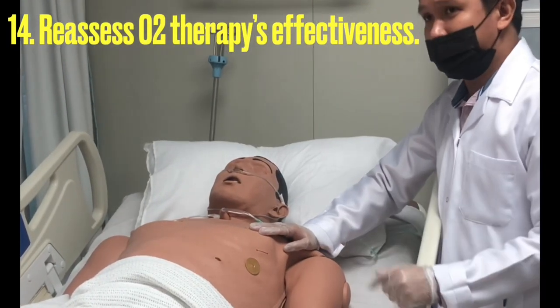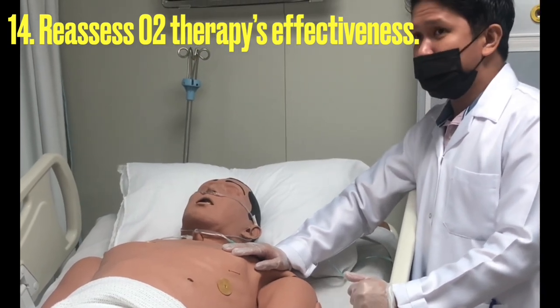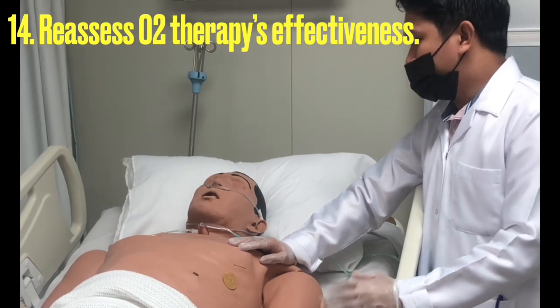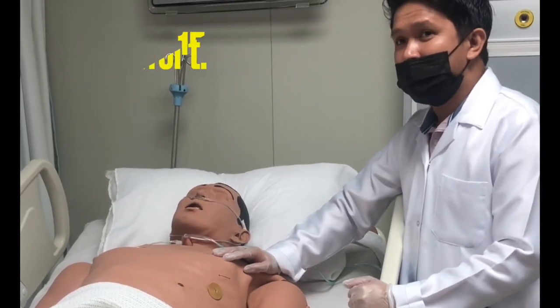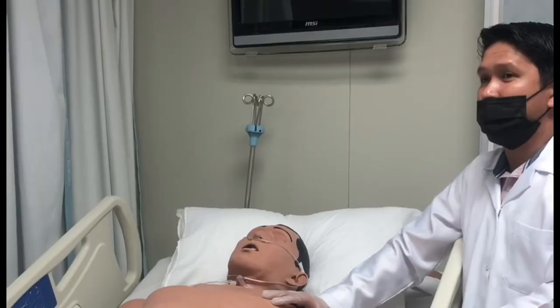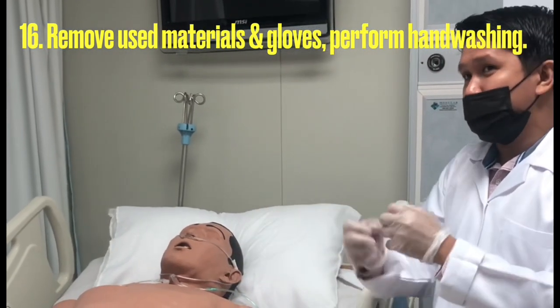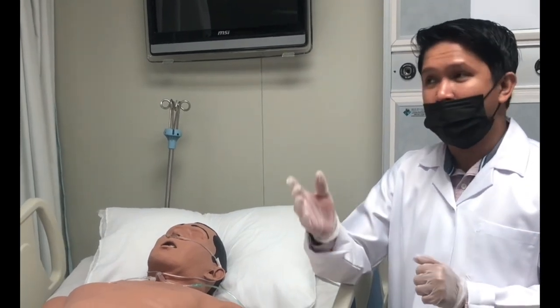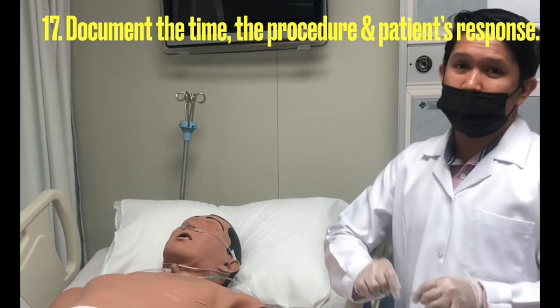'Mr. Muhammad, I'm going to return to you after 5 to 10 minutes to check again your respiratory rate, your breath sounds, and your oxygen saturation, and to check whether our oxygen therapy has been effective.' The next step is to ensure the patient's comfort, then remove the used materials, remove your gloves, perform a post-procedure handwashing, and finally, document the procedure.